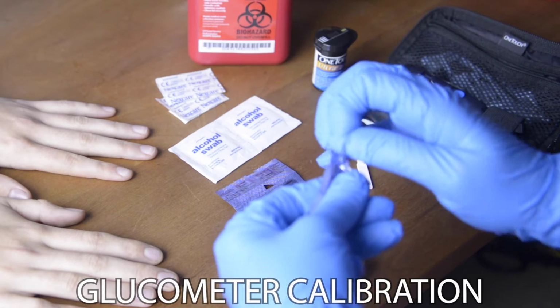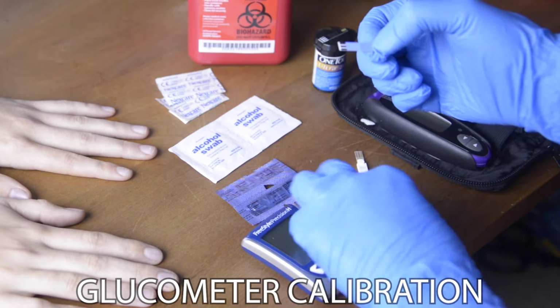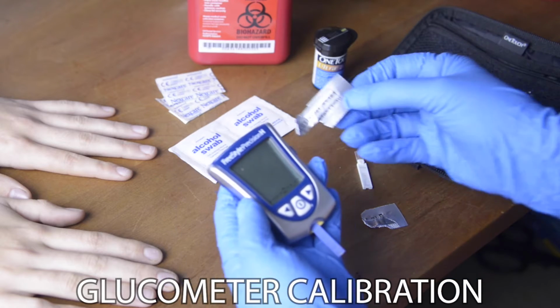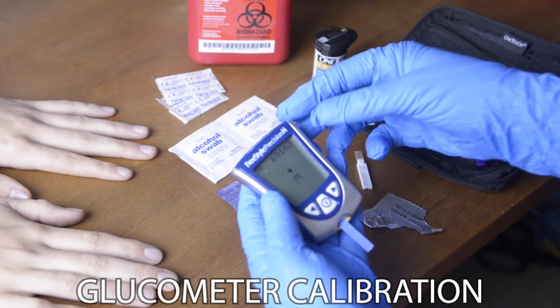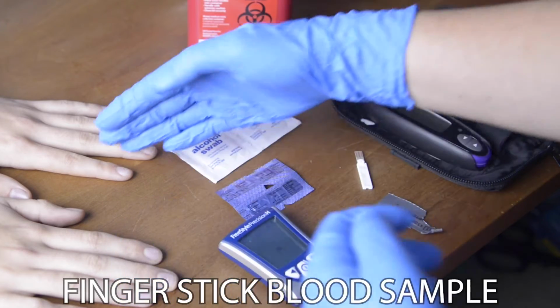So I'm going to open my test strips, bring it out, and place it in the meter. And I will ensure that it says 69163. It's now asking for a drop of blood. So I'm going to be testing the blood glucose of my patient here.